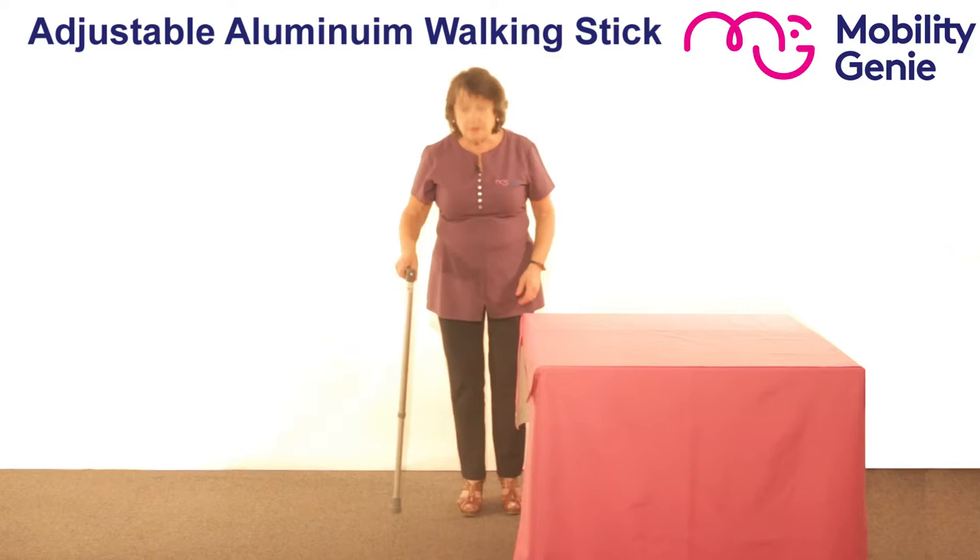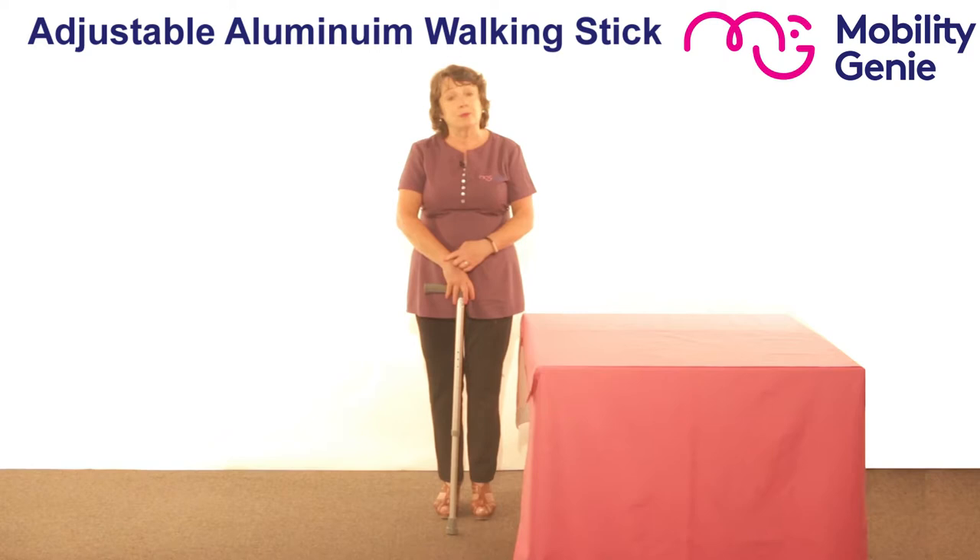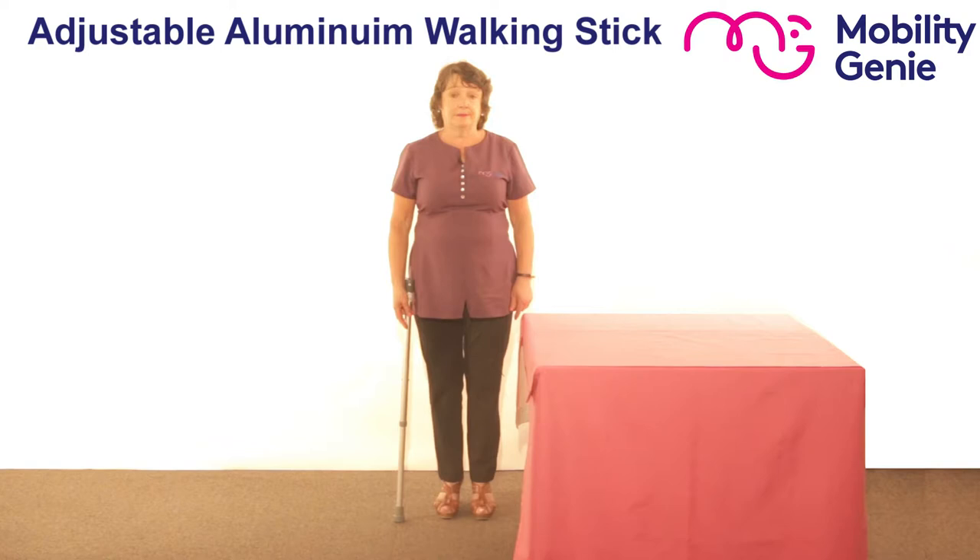So just to show you how to measure somebody for a walking stick. When you have the person standing with their hands by their side, you measure them to the wrist bone — that's the knobbly bit of the wrist bone. So you can see with me, the walking stick is exactly the right height for me.